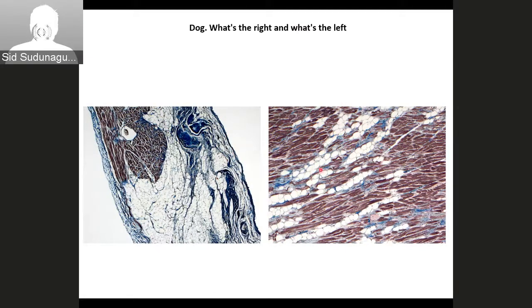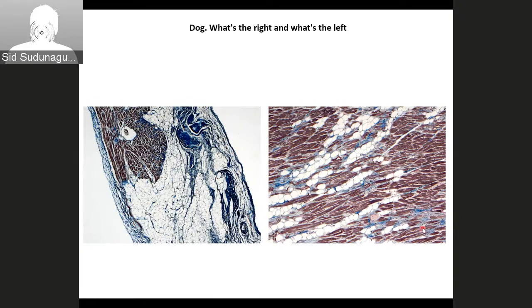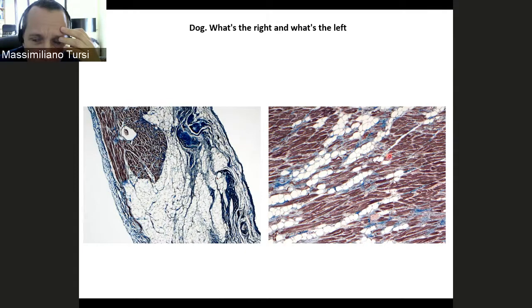Oh, okay. Because in the left image it's nearly all replaced, whereas in the right image there's still quite a lot of normal myocardium. Yeah, there is a multifocal group of adipocytes. And of course, there is also multifocal small interstitial fibrosis, and also myocardial bundles.